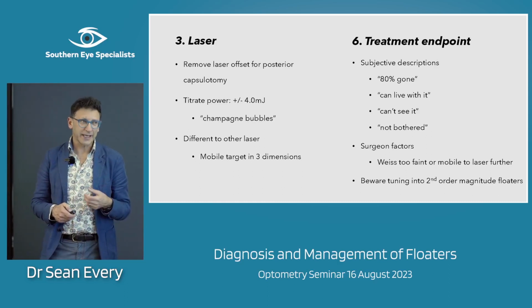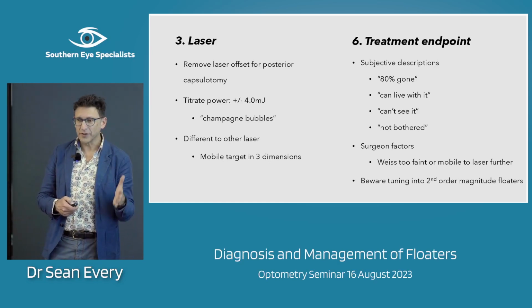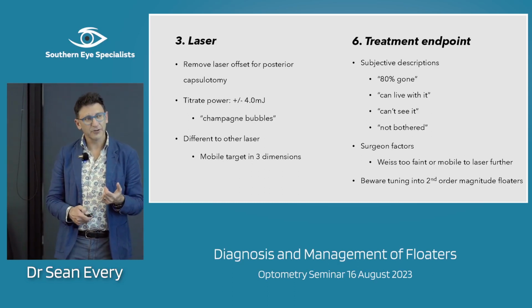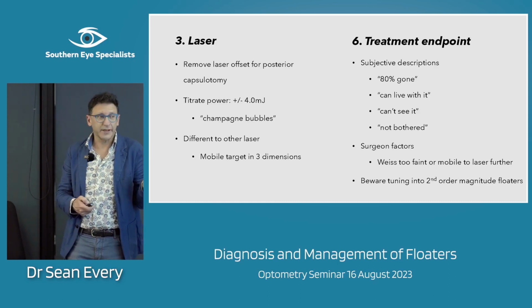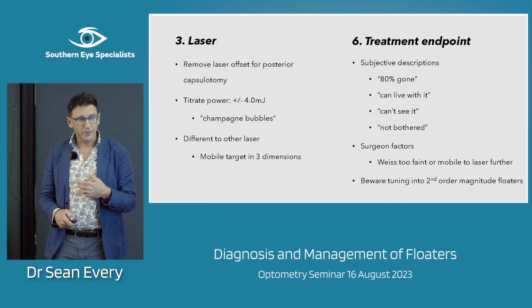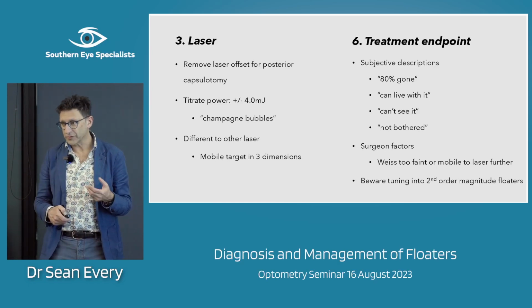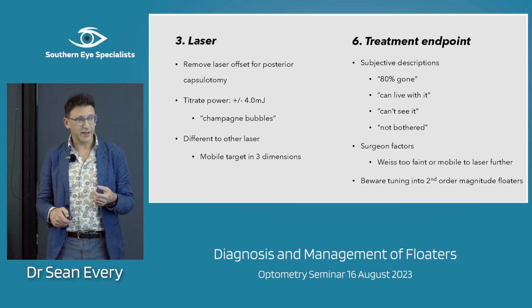So what's the treatment endpoint? Like a lot of things in VR, the treatment endpoints are not precise, and they're rather subjective. But there are comments like, 80% gone, I can live with it now. Can't see it, not bothered. These are real patient comments. And from my point of view, either it's too faint and I can't see anything more to usefully laser, or it's too mobile, or it's suddenly not in a safe place.